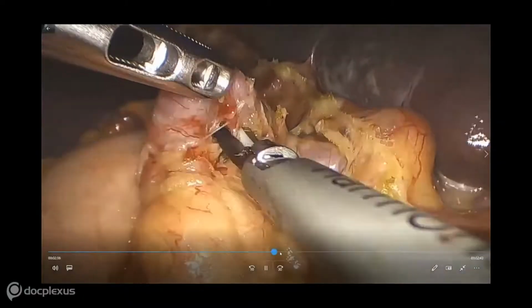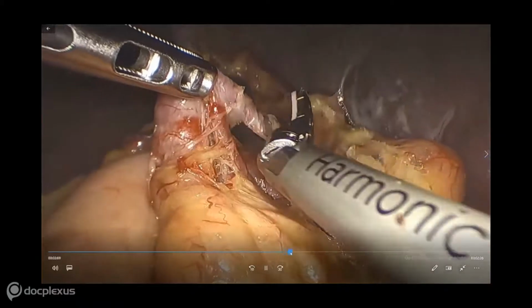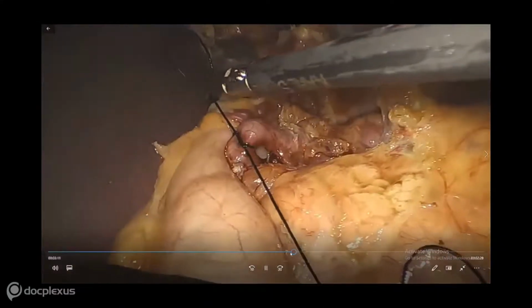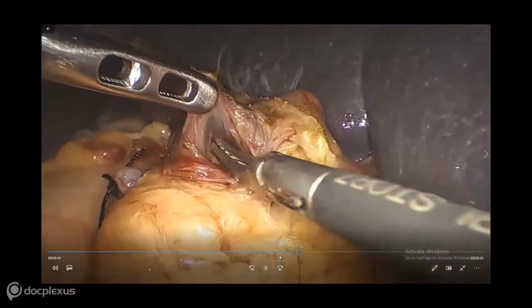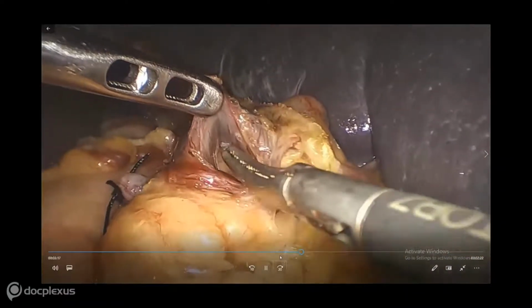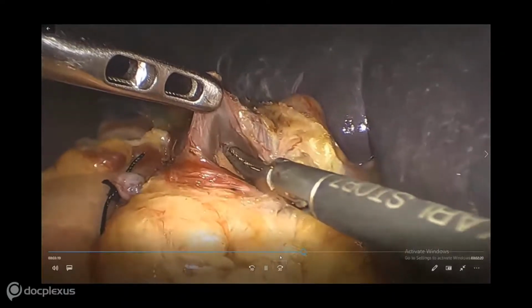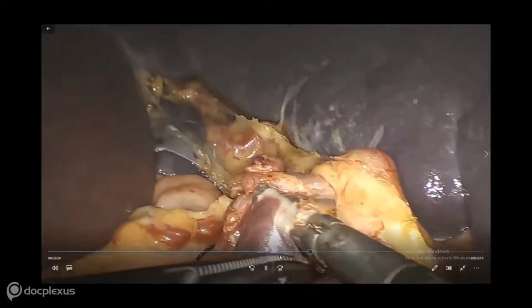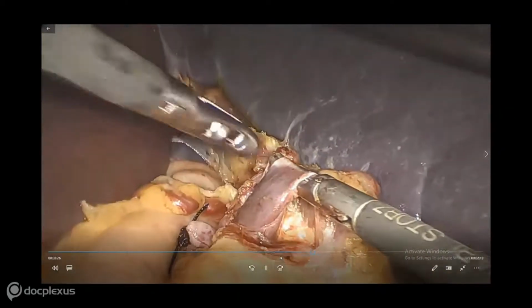And there will be some branches coming from the splenic artery going to the pancreas, which can be divided. And this is the splenic vein, which we are dissecting carefully. And we will be ligating with at least 2 or 3 sutures on either side, and we will put clips also. So this is the splenic vein which is being dissected now.